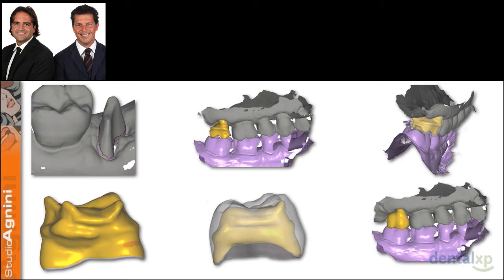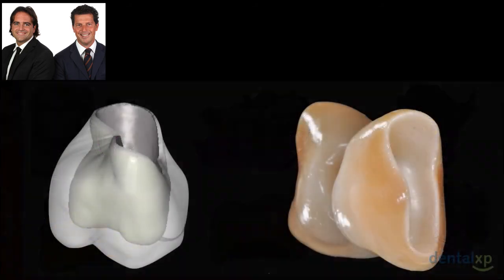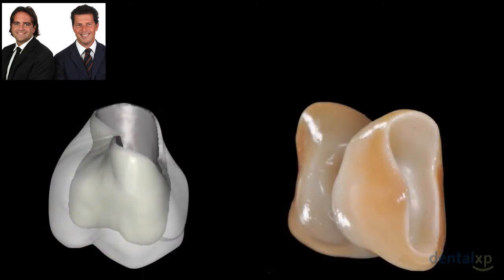You can see how Luca Dondi in this case is working in the CAD part and designing the framework, using the zirconia as a dentinal layer and giving support in areas that he thinks are weak, in order to increase the strength of our final restoration and give longer term stability. And here you can see the final crown digitally and clinically, left side and right side.